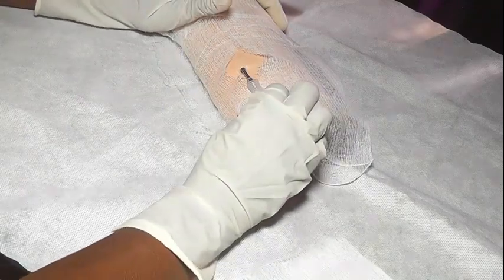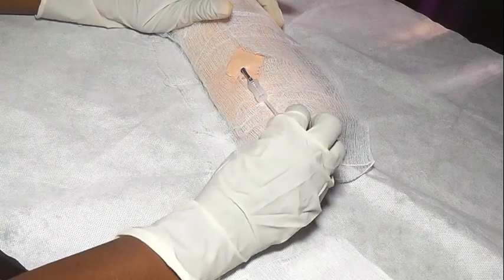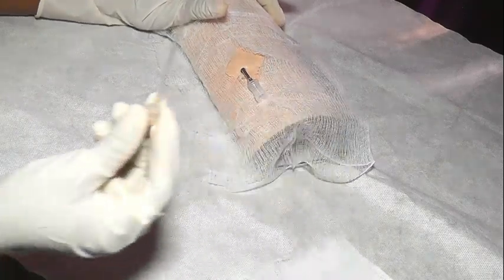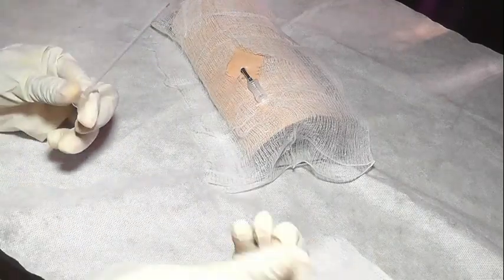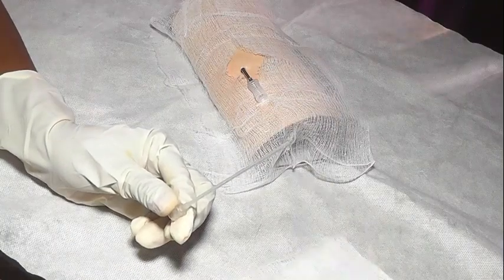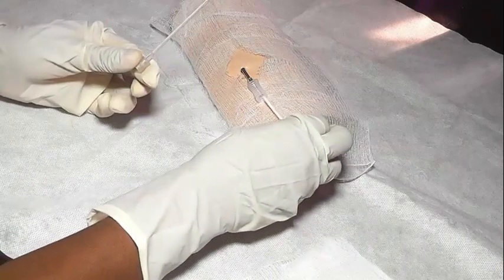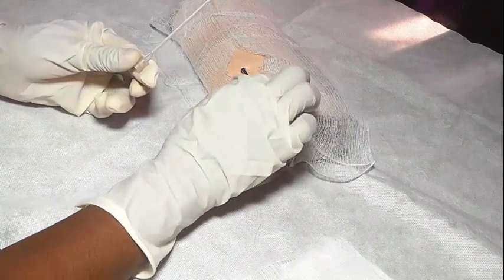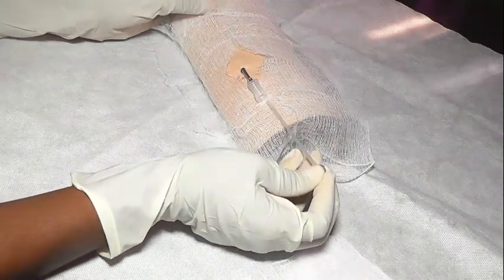So I'm going to withdraw the plunger now. Okay, I will use my sterile hand. Now you can use your gloved hand or tweezers to pick the rod. Then you gently insert it. Alright, I'm going to use this plunger to push it in.